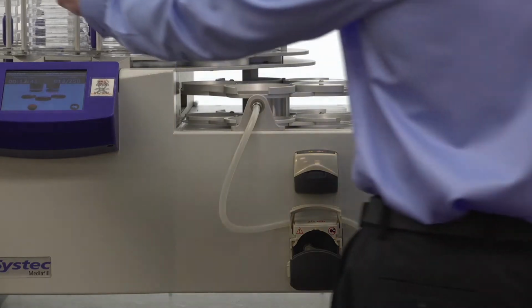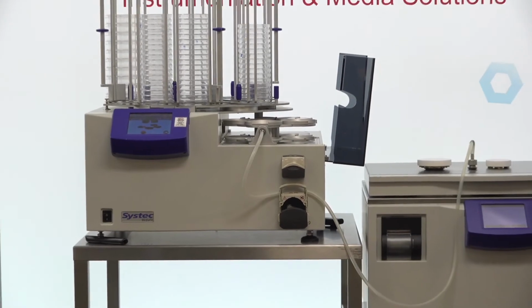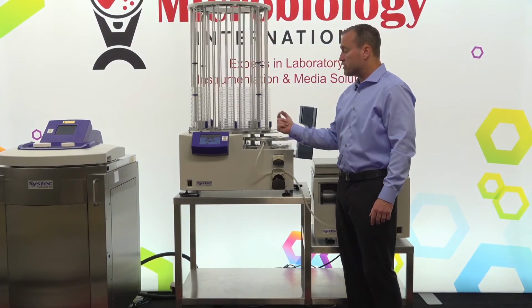So I have a couple of columns that are empty here. It's going to run through those columns. Once it runs to a column that's empty, then it will pause. So one column is completely emptied, and once that is completely emptied, it would transfer to the next.